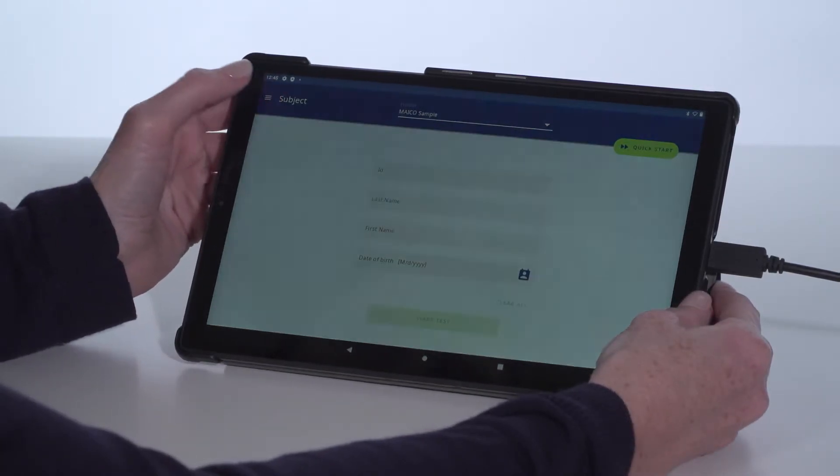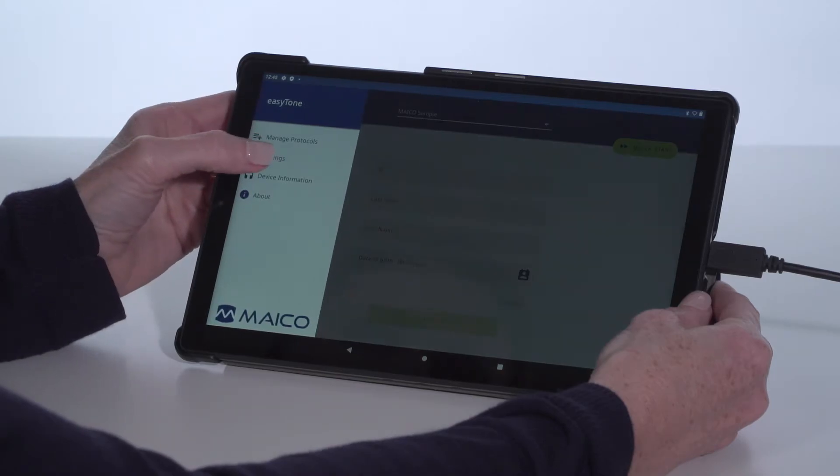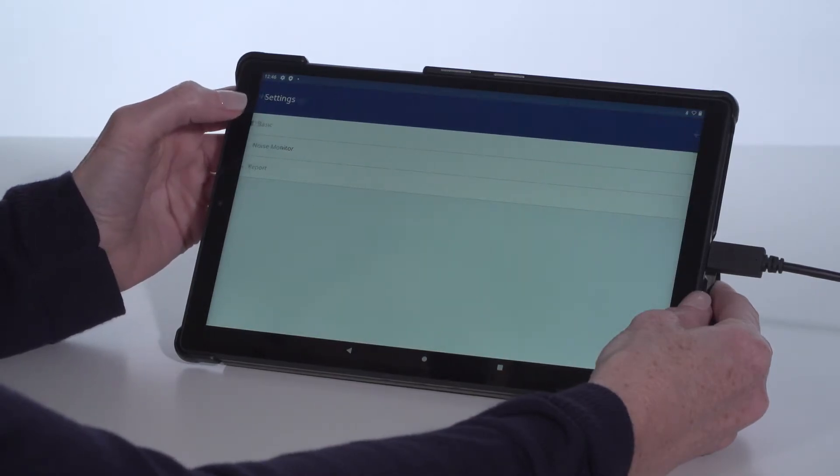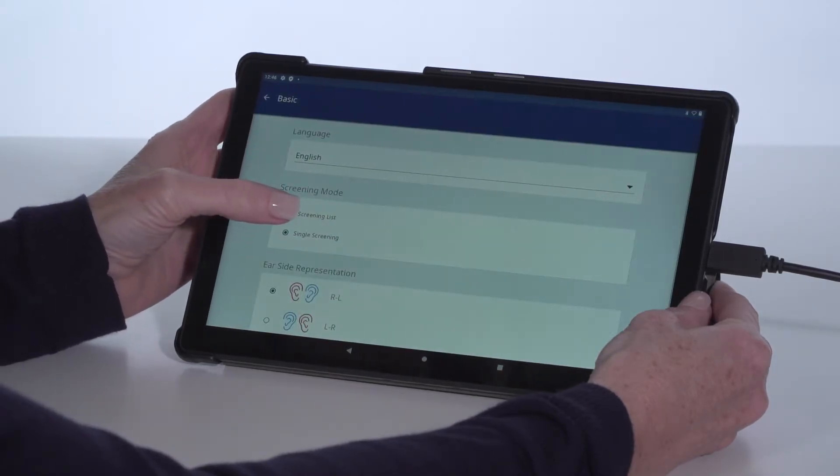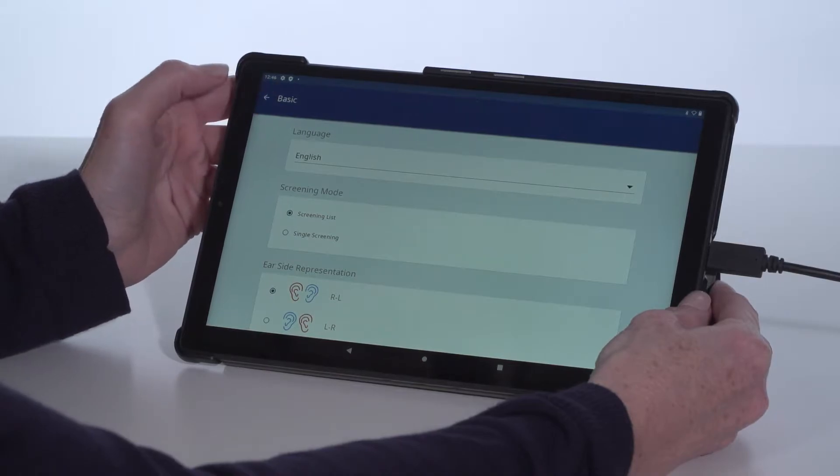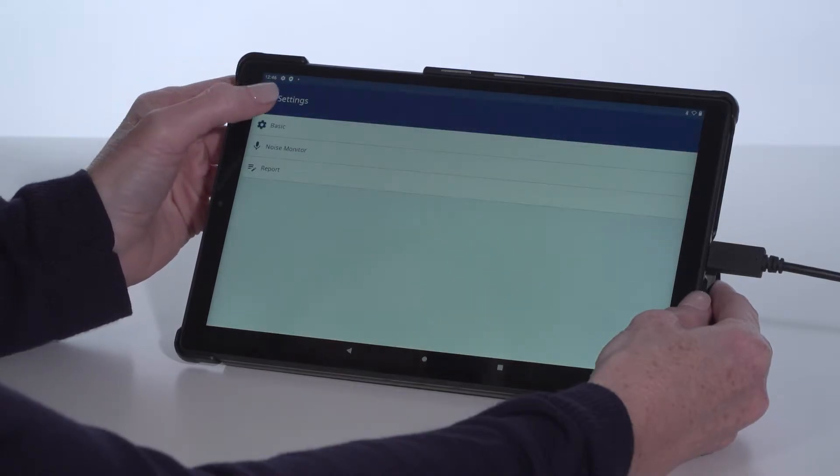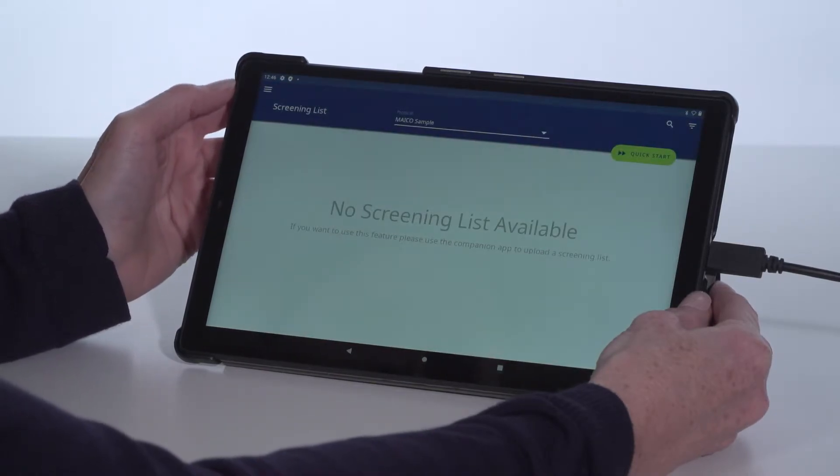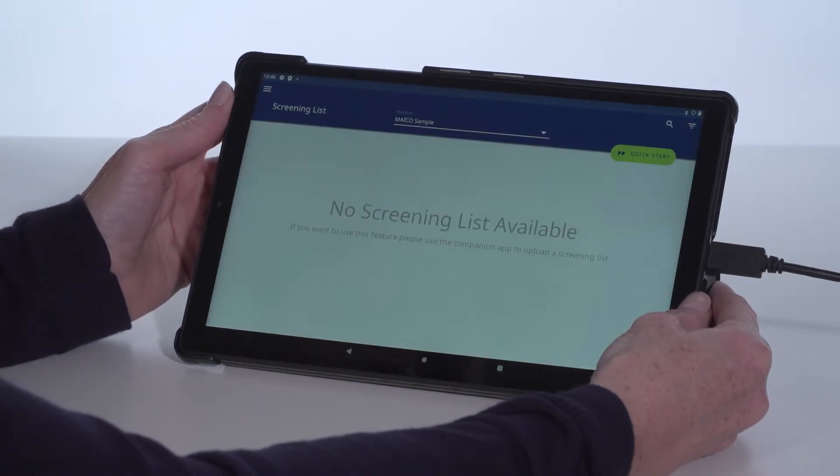The second home screen option is a screening list. This allows the importing of a full list of subjects by using a secondary tool called the Mako Companion app. Results are then stored for a limited time to manage later.